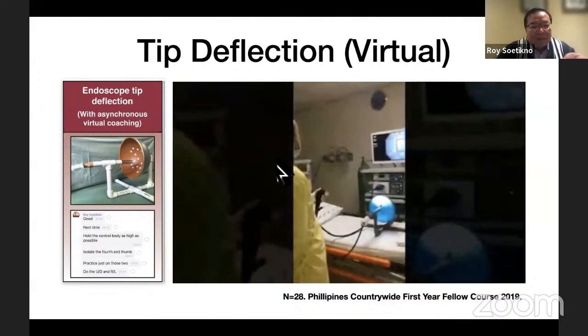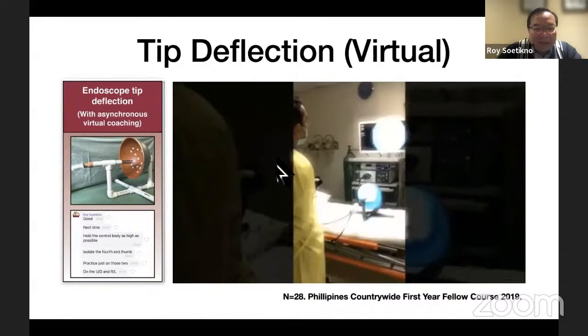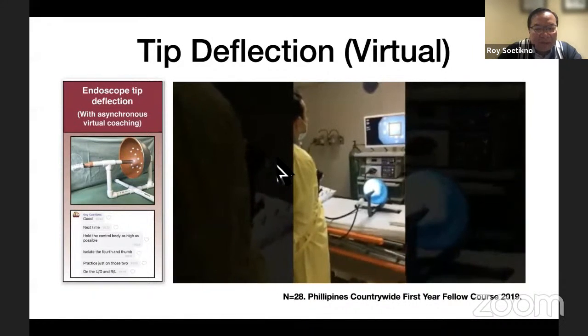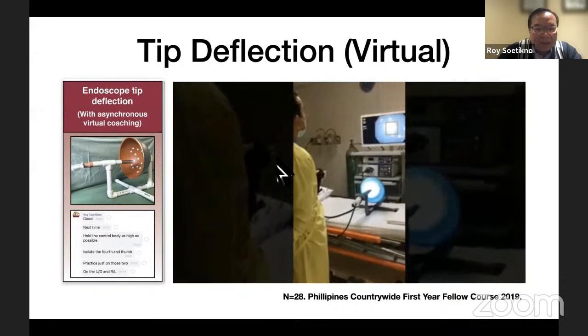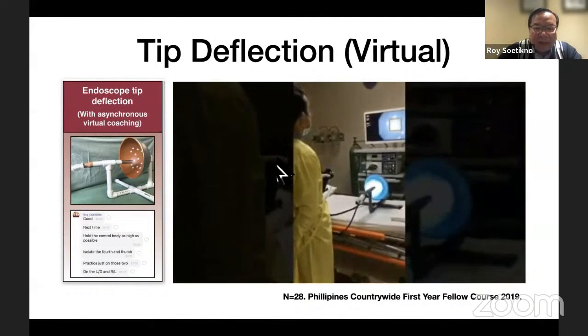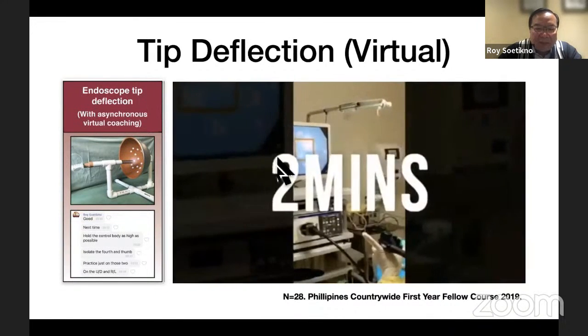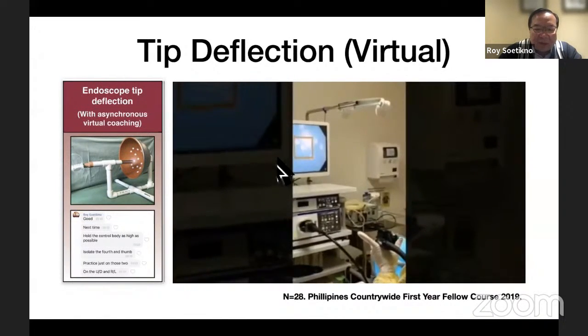So the first step is to have the trainee use a low fidelity simulator. This takes about 2 days, whereby they activate their hands and all of their muscles, all the parts of the brain that control those hands.